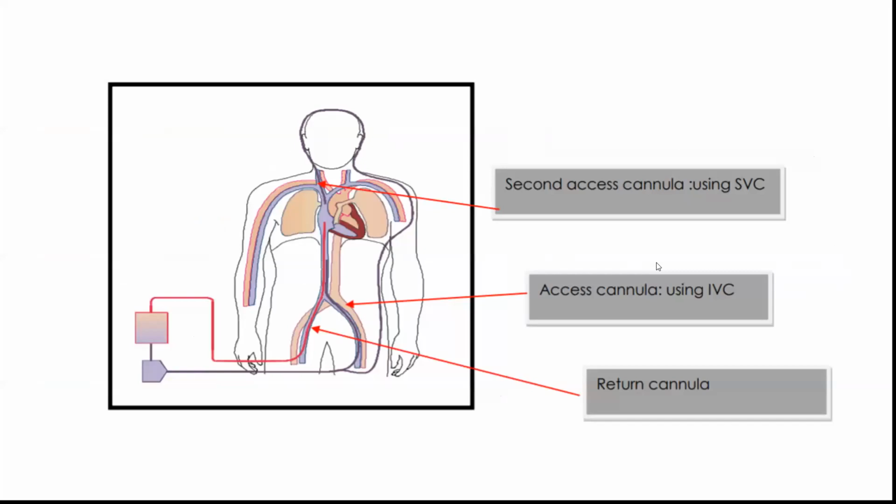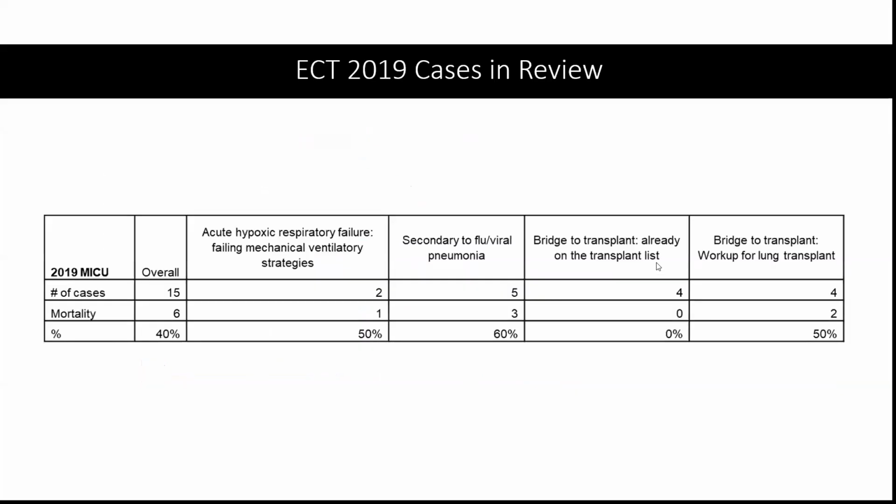And then if you go through all of those and everything's completely normal, that's when you say, okay, maybe my cannula size just wasn't right. Maybe I didn't assess this right for this patient and I need to put in a second drainage cannula, which means that I'm taking more liters of blood to my ECMO unit to be oxygenated and go back to the patient. All right, so that's basically it.